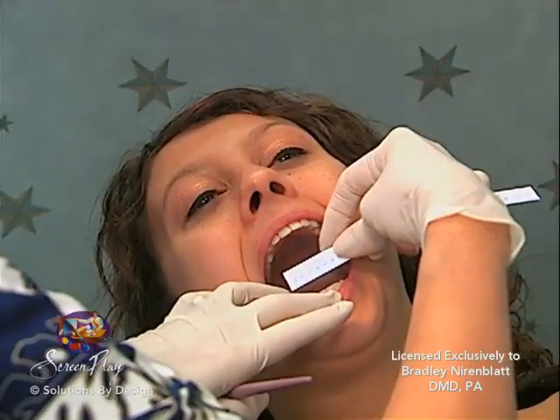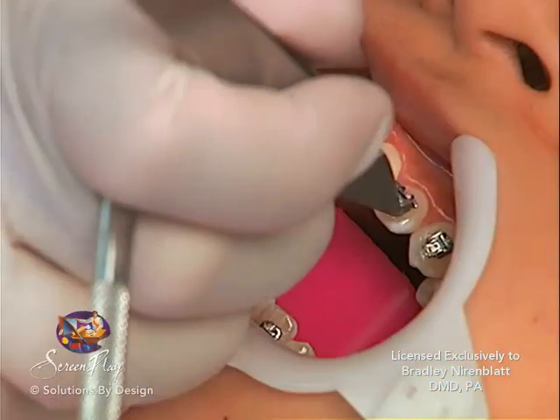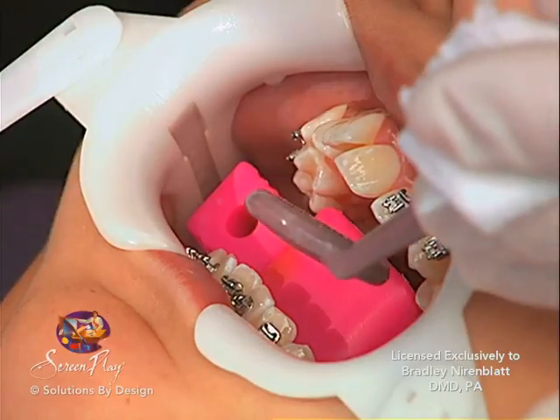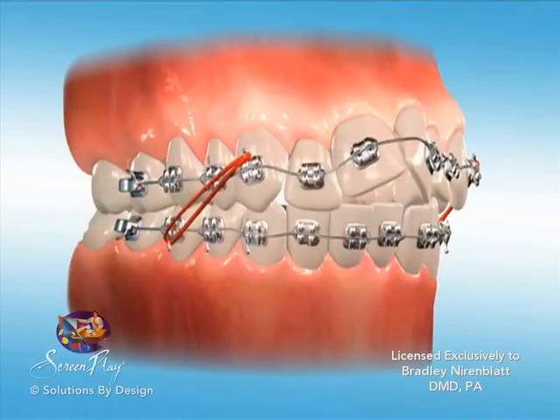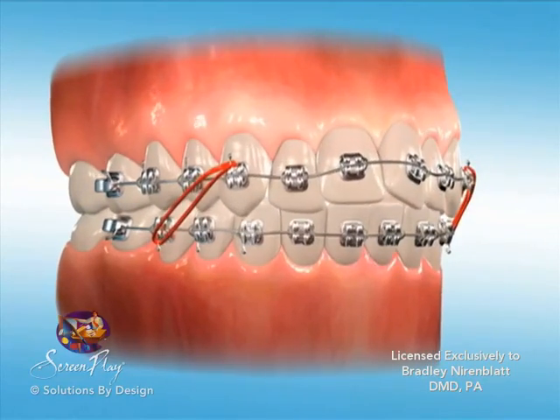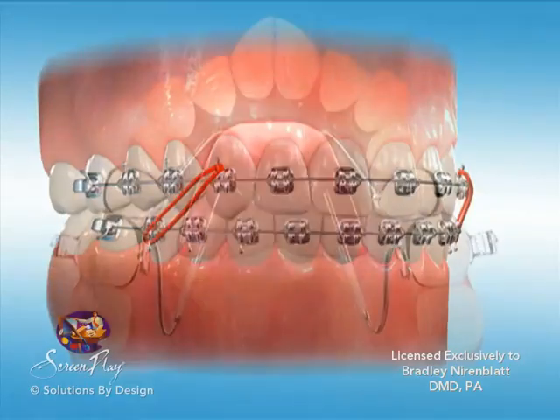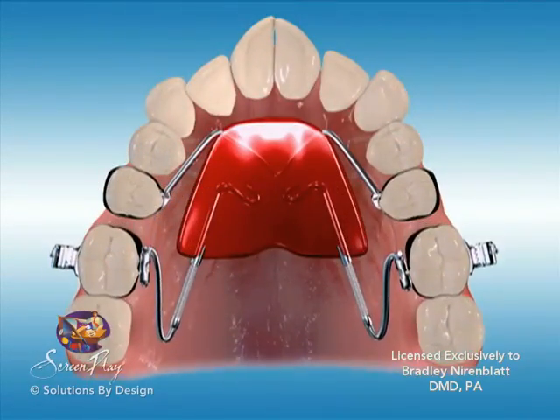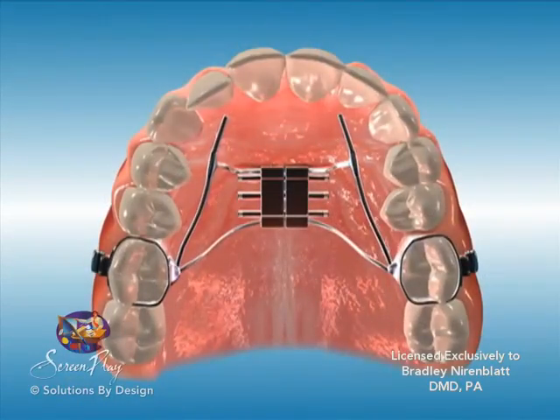Braces are the most common appliances utilized in orthodontic treatment. Only after a comprehensive orthodontic examination, including diagnostic records, are braces placed. There are many varied types of brackets and wire systems utilized in orthodontics. Each has specific characteristics to achieve a predetermined treatment goal. And just as there are many different types of braces, there are just as many varied philosophies or techniques practiced.